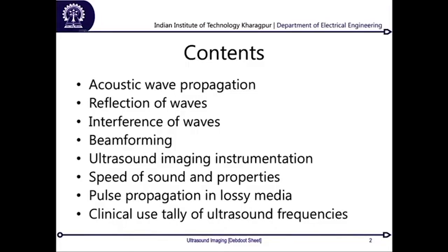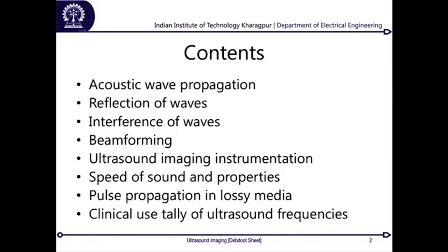After reflection of waves, I would be speaking about the interference principle between waves, which actually helps us in creating a very practical application called beam forming in ultrasound. Now often if you go through literature, you would come across this term called ultrasound beam.